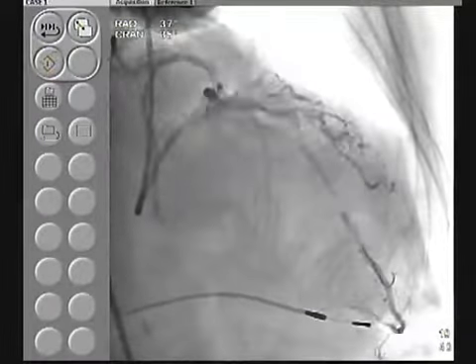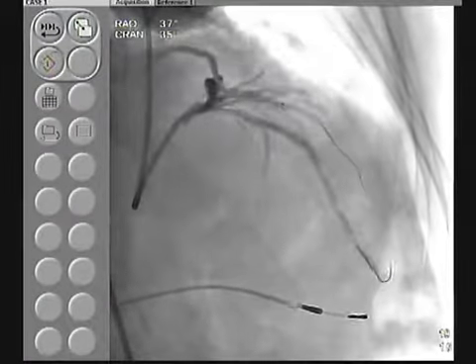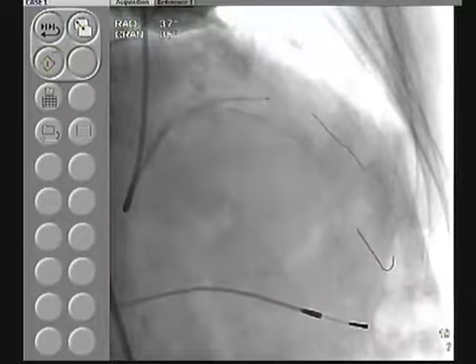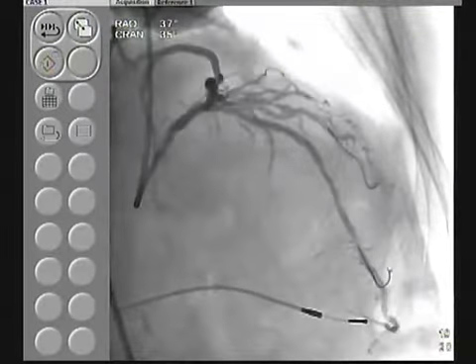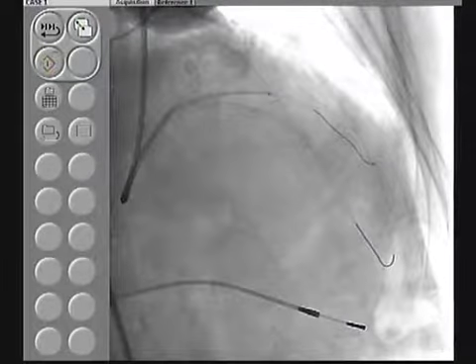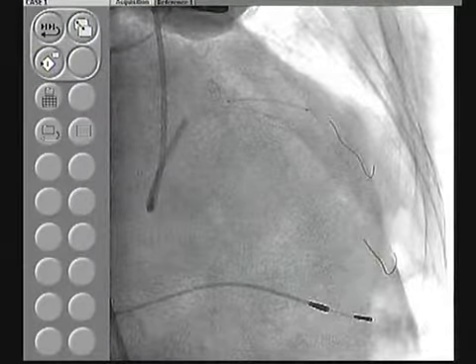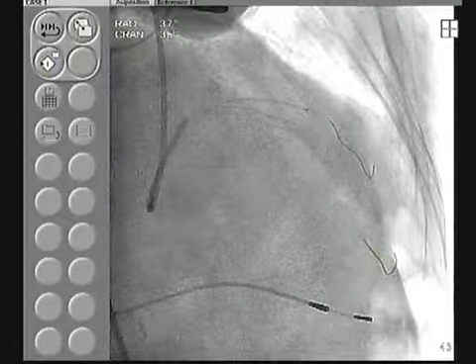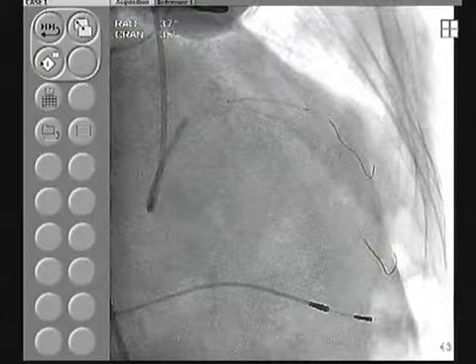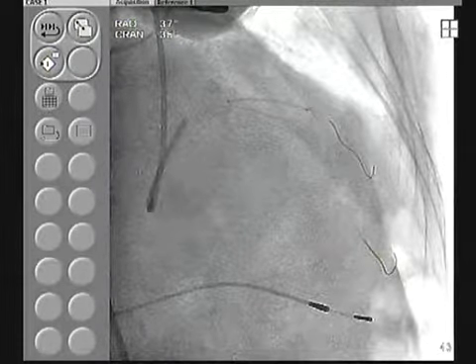Then give me a 3-0, another 3-0, 23. Anu, you want to angulate the angiographic view a little or decrease it, to see how far proximal? I'm talking about proximal LAD, how ostial, to the ostium. We can't create another ostial one.